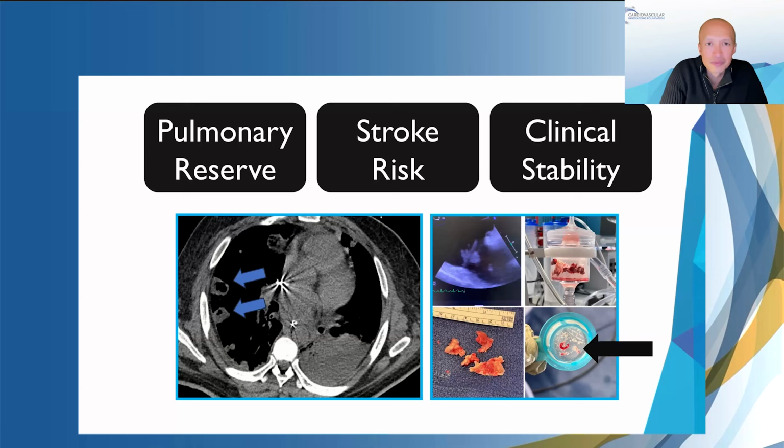Sometimes we see them after the procedure when we extubate them. And everyone's screening for PFOs. What do you do for PFOs in these cases? If there's a good PFO, then I think that a discussion around cerebral embolic protection becomes important. But otherwise, without it, I'm obviously not too concerned.